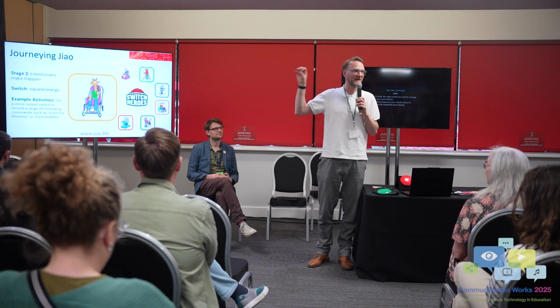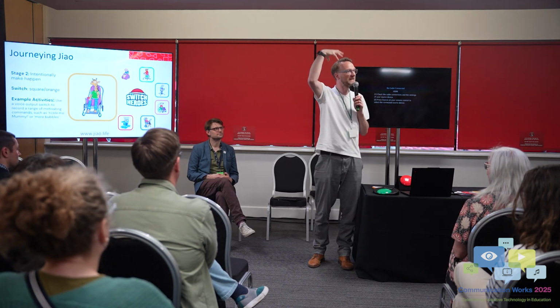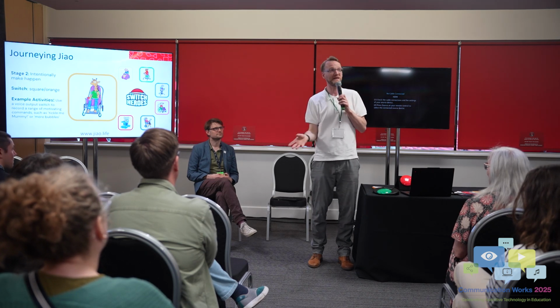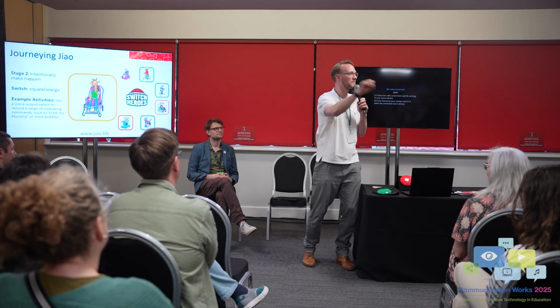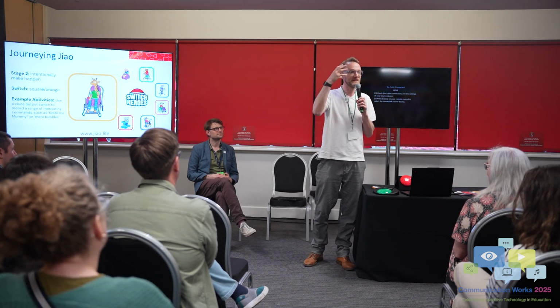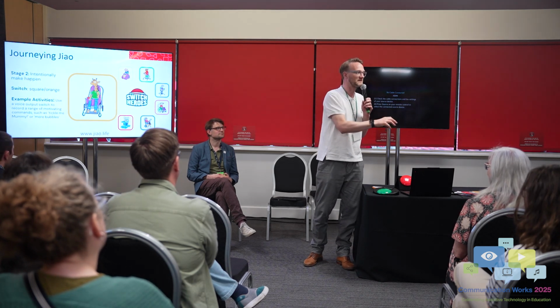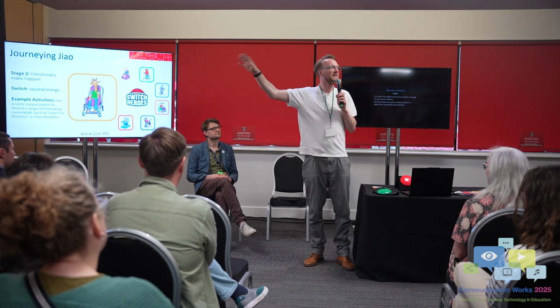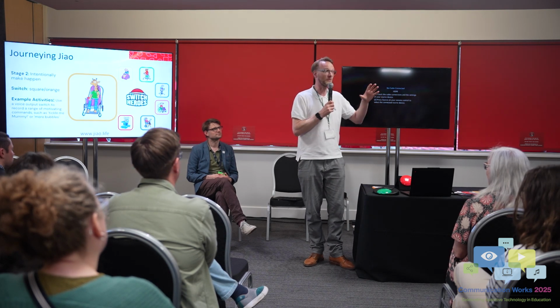So when it comes to technology, we often forget about the child as a human being and a brain, and we're focused on, I'm going to get the right switch and I'm going to put it in the right place and get the right activities. Whereas if you think of what Charlie was saying before, like moving the switch around, that really is working on them understanding that when they impact a switch, it does something, no matter where it is. If they enact on it, then they can control something in their environment. And that's what you want to start with, not trying to find the right switch, trying to find the right position.